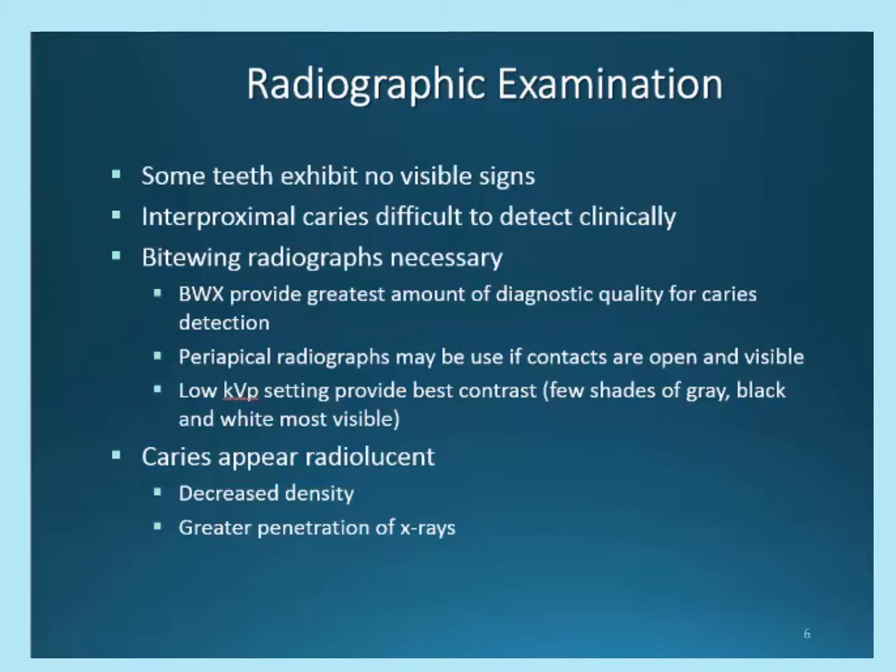Periapical radiographs, if done properly, are also excellent in determining interproximal visibility. But remember, the angulation of these radiographs does affect the quality of the image and therefore the interpretation value of the film. The angulation of bite wing radiographs has little to do with vertical angulation, which makes them the best image technique for decay detection.